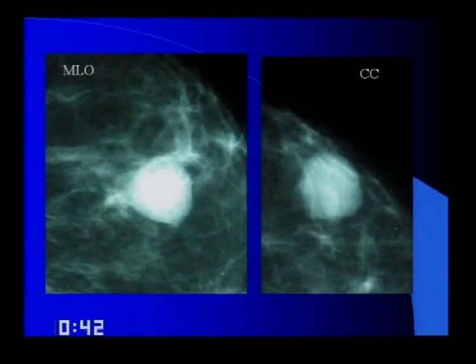If you have a nodular density, fairly well circumscribed, in a young woman, what's your first diagnosis? Well, yeah, like a fibroadenoma. And this is not a cystic lesion. It's got some internal echo character, and it shadows. It's got some posterior acoustic shadowing. And was any Doppler done? It was. Fibroadenoma is what I'm thinking now in a young person.